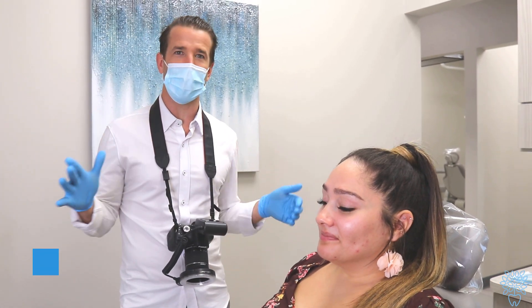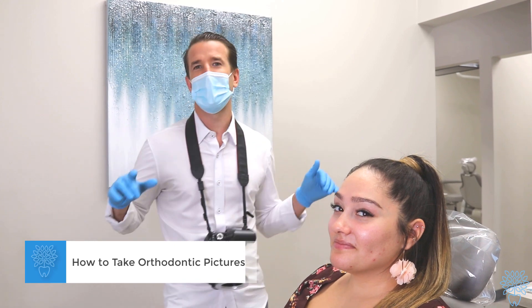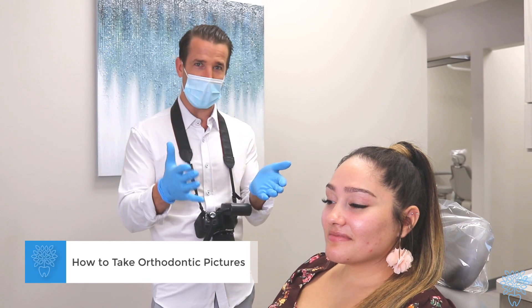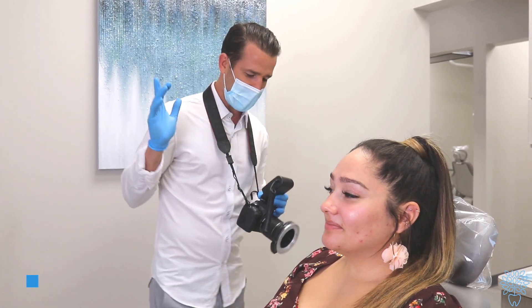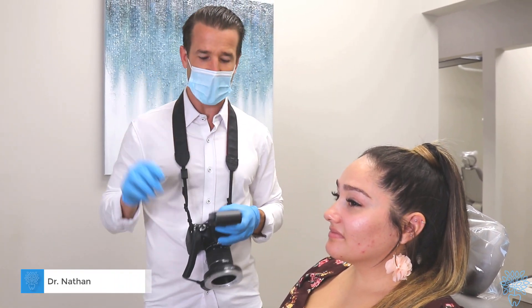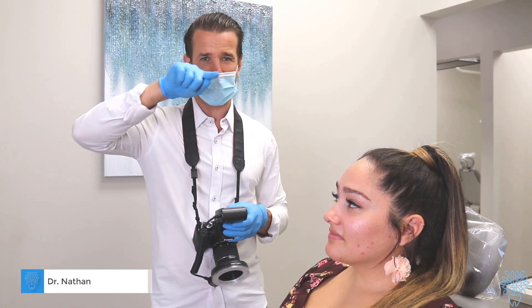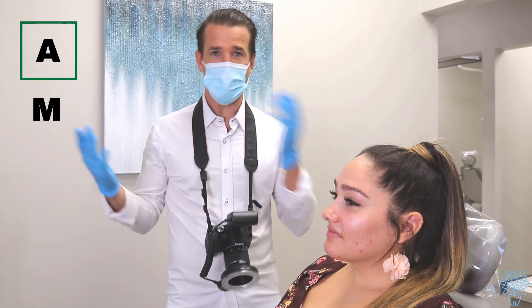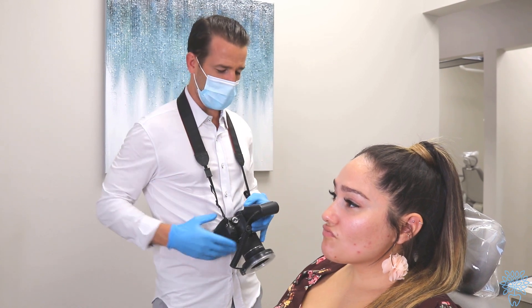We're going to explain how to take orthodontic pictures, which is very important. There are basically two settings on the camera we use: one is A for automatic, which has a green symbol, and the other is M for manual — we sometimes call it 'mouth.' Those are the two settings we use.